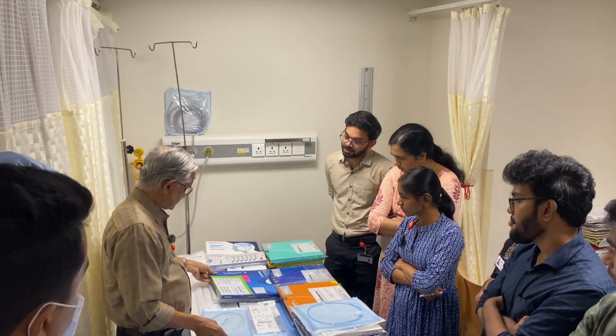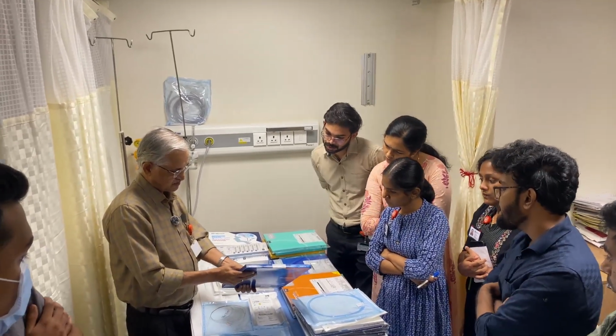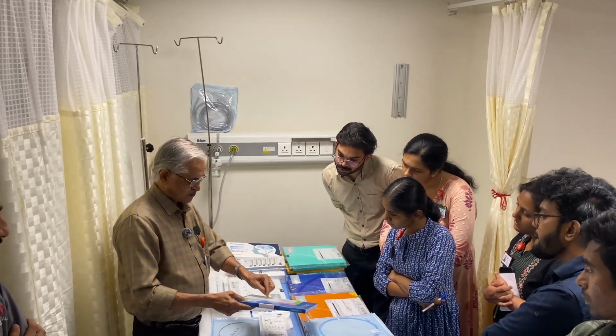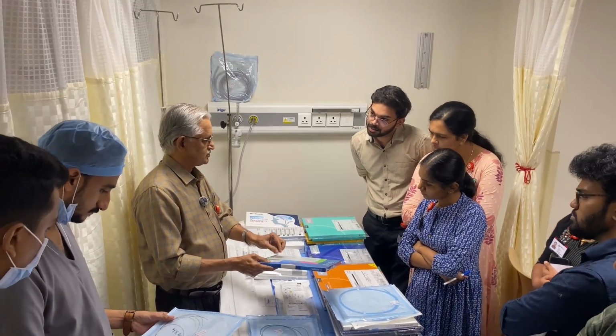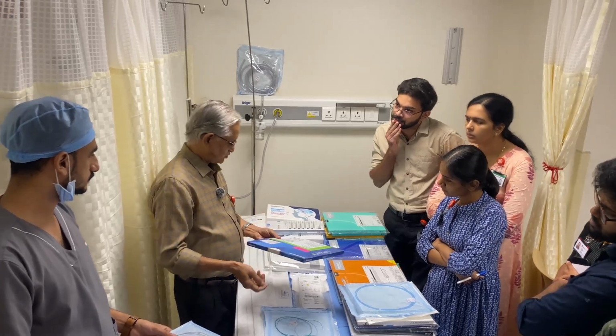And this is a stent retriever, a Solitaire. So this is the microcatheter. Once you push this one, it will open up beyond, in the normal artery. And then you pull it out. The clot will be pulled out.